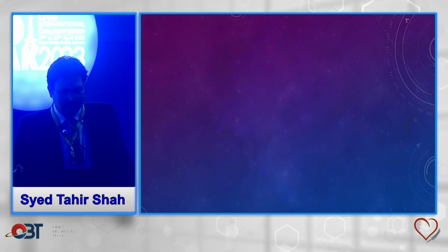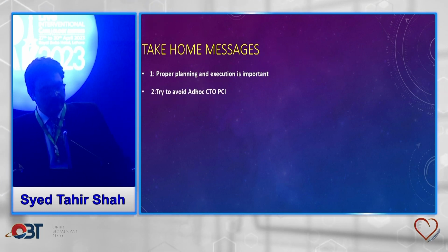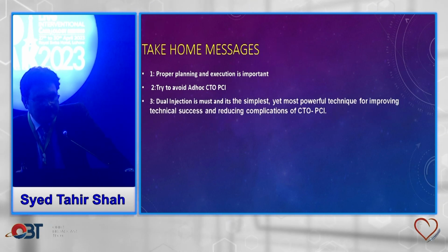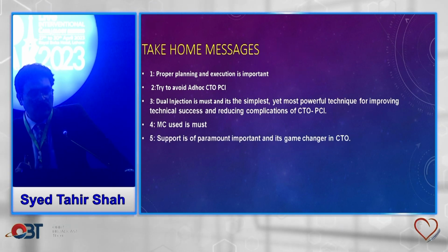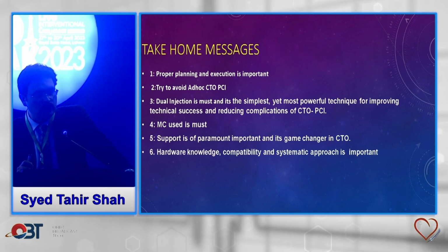Fundamentals of CTOs, and this is the conclusion. Take-home messages. Proper planning and execution is important, number 1. Try to avoid ad hoc CTO PCI, number 2. Dual injection is a must, number 3. Microcatheter use is important and essential. Support of the guiding catheter is of paramount importance, and it's a game changer in CTO.